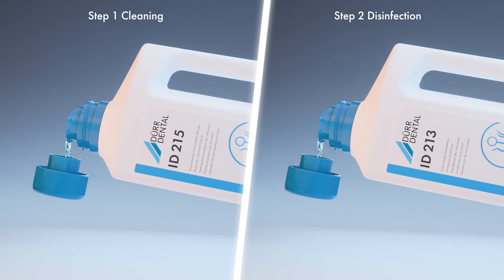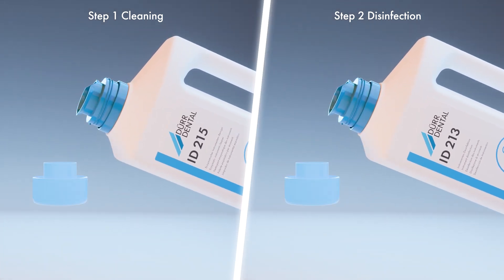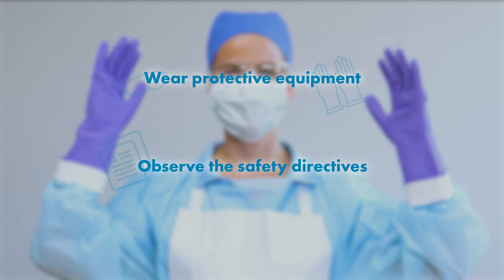The solution must be dosed in accordance with the manufacturer's instructions. Always use an appropriate dosing feeder for dosing. Please wear personal protective equipment and observe the occupational safety directives.